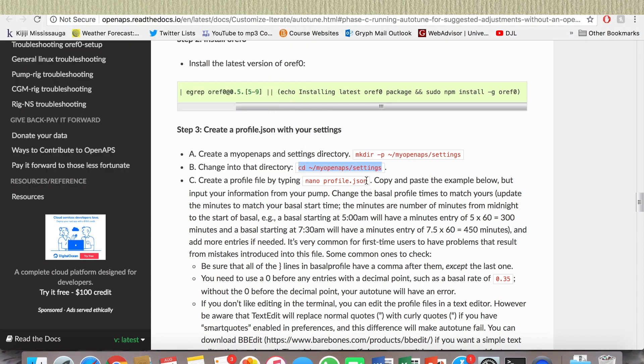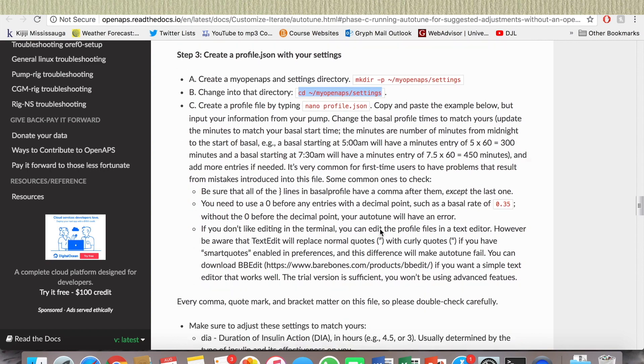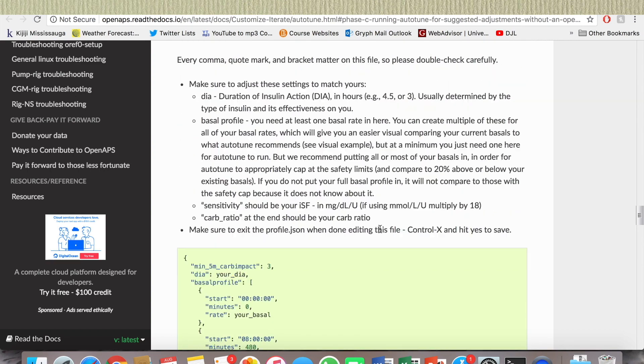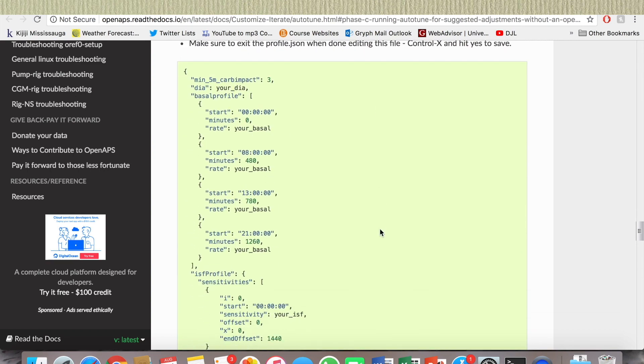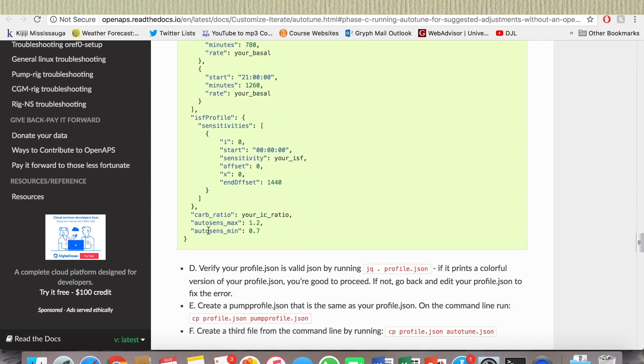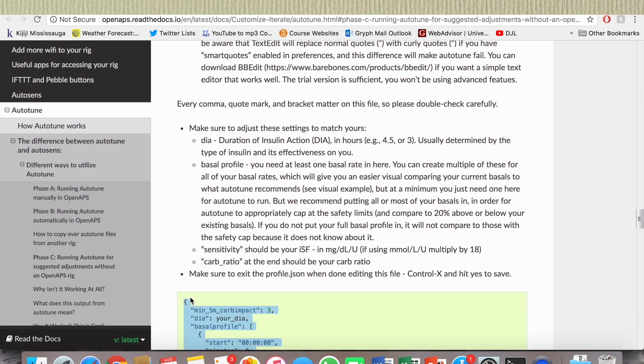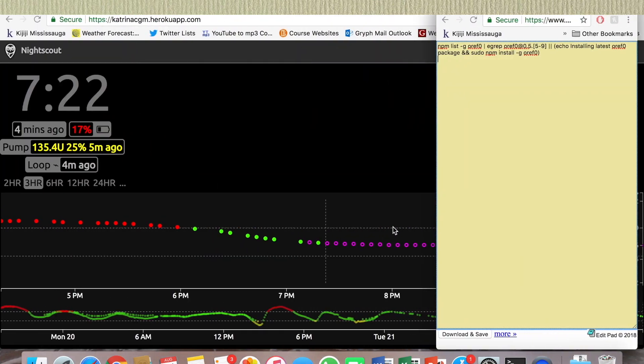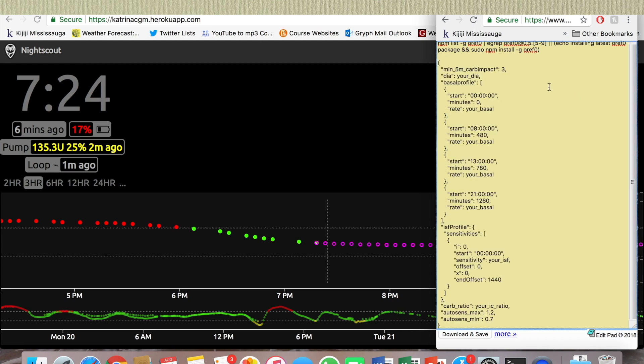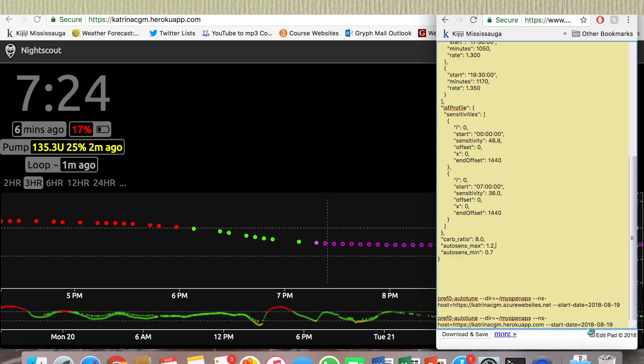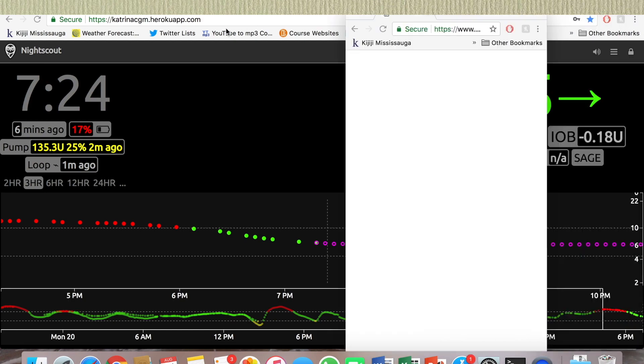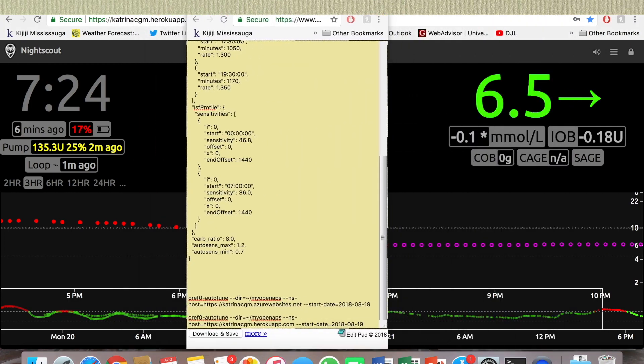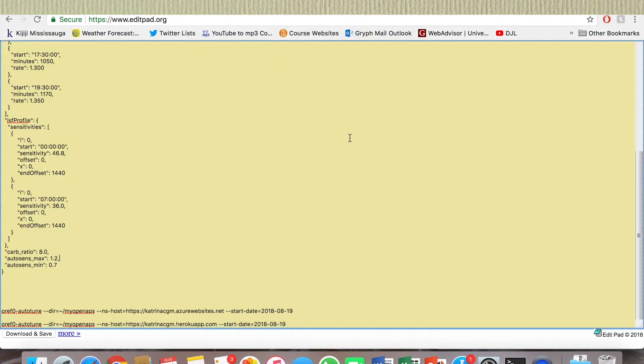Okay, create a profile by typing that. Copy and paste example below but input your information, so I'm gonna set that up first. I'm gonna copy this whole thing and paste it in my plain text editor. I had the information from when I did it before, but I'm gonna redo it.